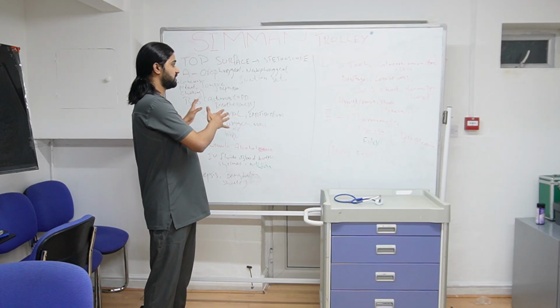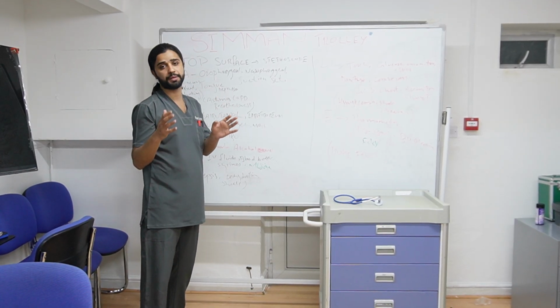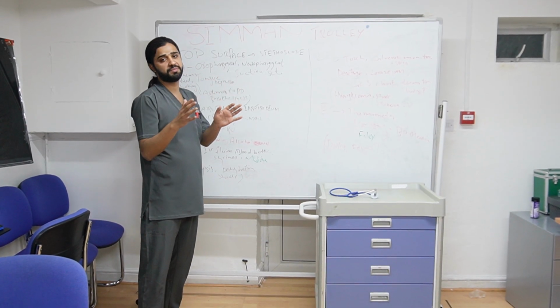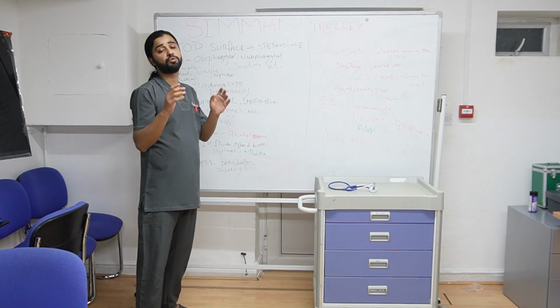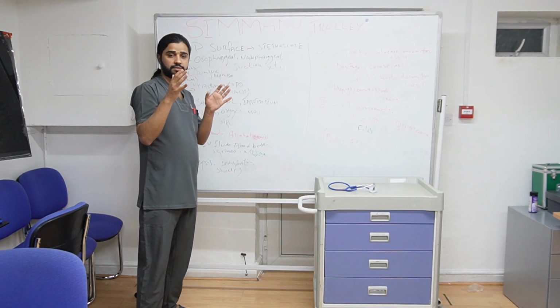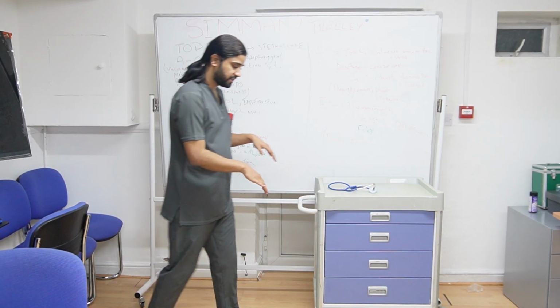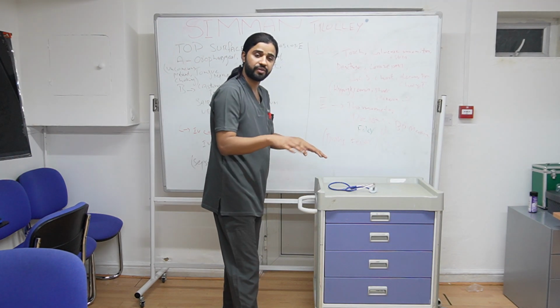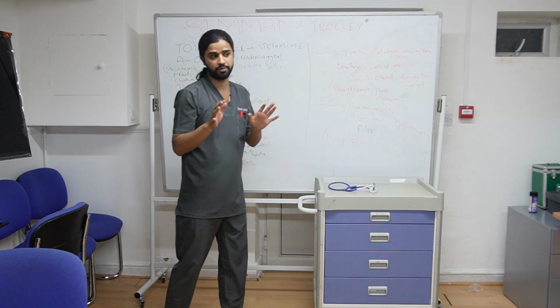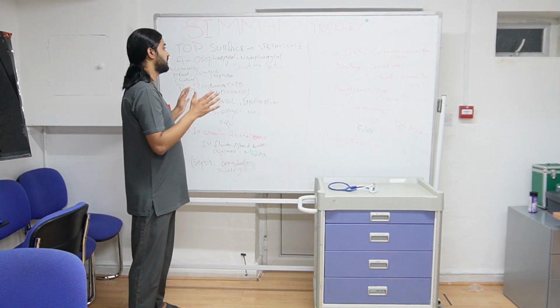So before discussing where you are going to find the relevant things, first I want to give you a pro tip. That is, always verbalize the thing that you are going to give to the patient. That is acceptable, more than enough you can say. If you are verbalizing the right thing, that would be acceptable. Suppose it is a morphine toxicity case, just try to search in C part for medicine, and if you are not able to find it, just say I am going to give my patient naloxone 0.4 mg. That is acceptable.